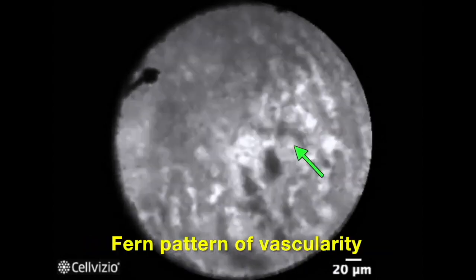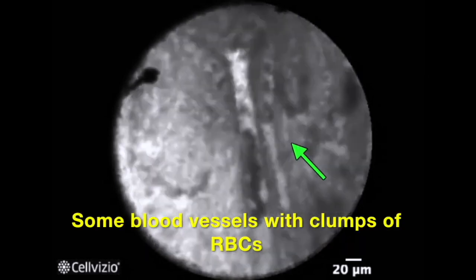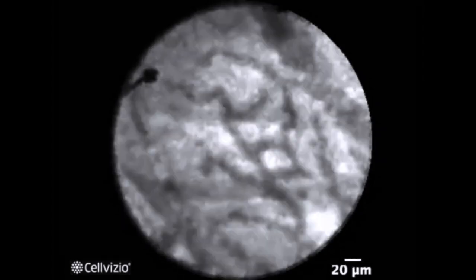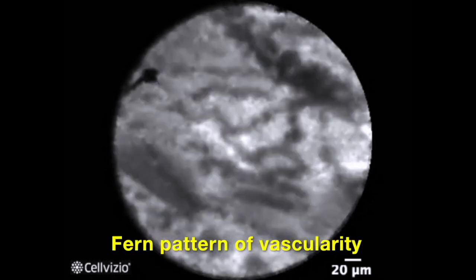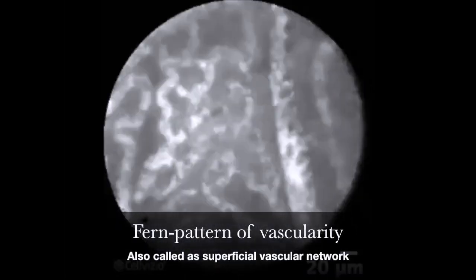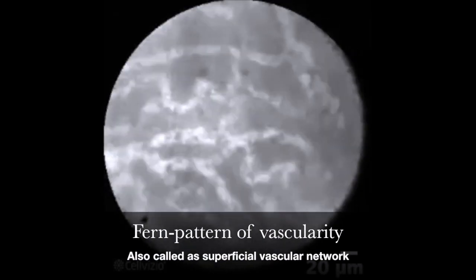In this example, you see blood vessels with flowing RBCs. There is a higher density of RBCs at certain areas. There is a very characteristic fern pattern as described. And here again there is a higher density of RBCs within those blood vessels. In this next example though, you see that the blood vessels appear much brighter compared to the previous example.